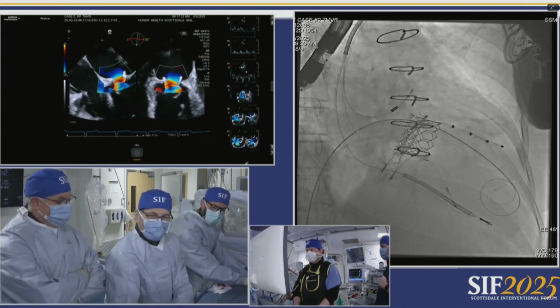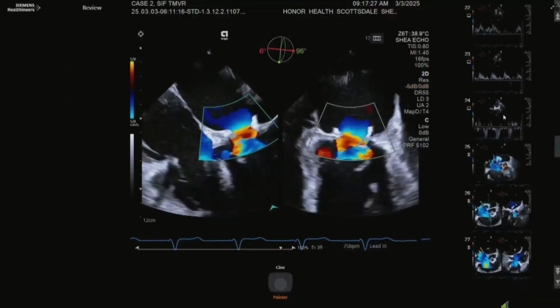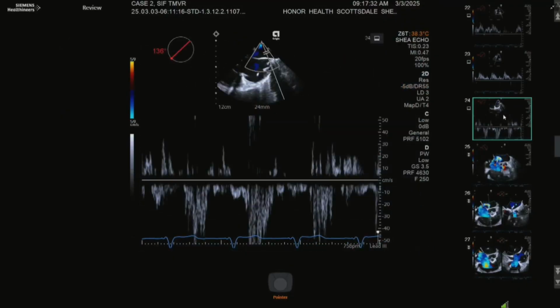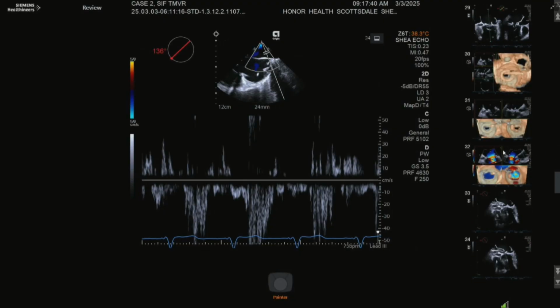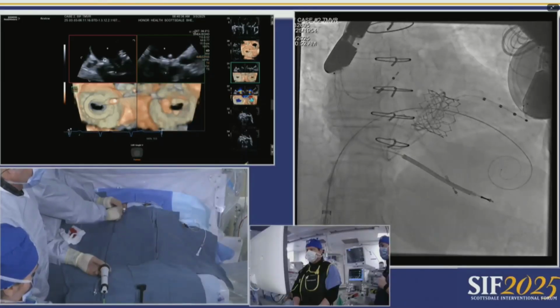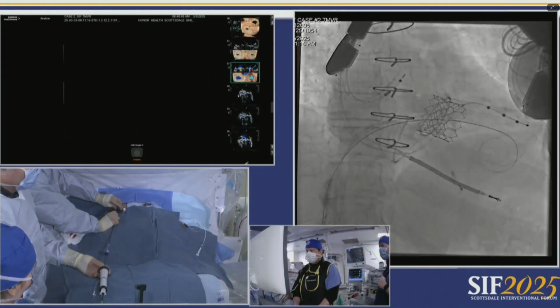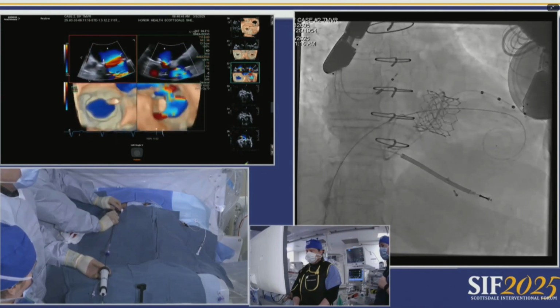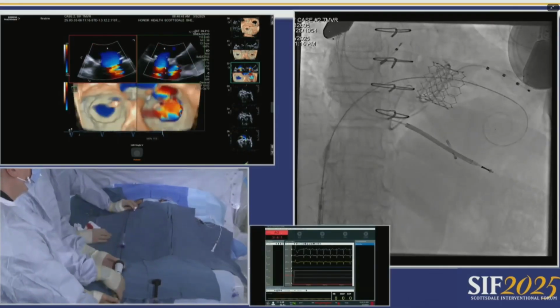If you guys want to start going up, it's fine. I'll start you go straight AP. Yeah, so baseline here, we have significant mitral regurgitation. We end up with the reversal of flow in the right superior pulmonary vein, so it's a somewhat eccentric jet here. Looking at it, we definitely have, as Dr. Reisman was saying, sort of a D shape to the entire complex. And we can again see that we've got significant mitral regurgitation. The mean gradient was 7 millimeters mercury at rest here at 75 beats per minute.